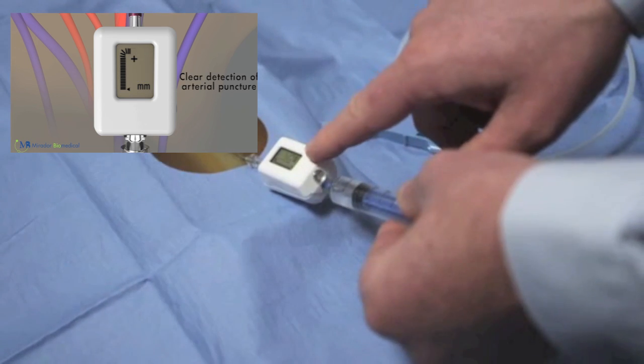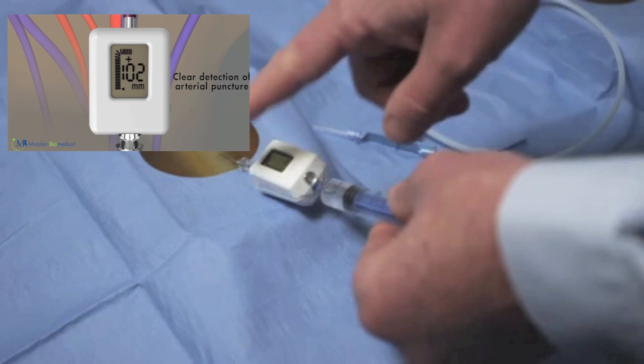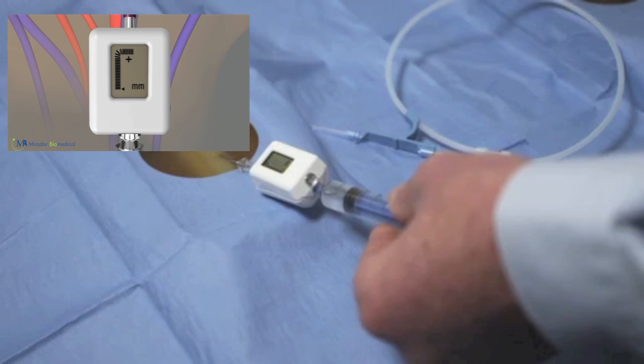And again you can see the waveform at the top, in this case representing the heart rate.